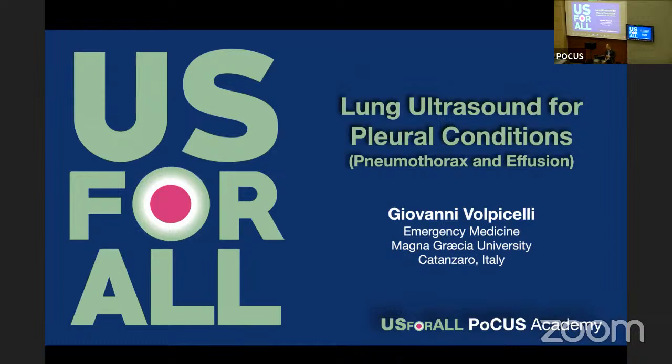This makes a difference in the patient's workup because in our practice, if the X-ray comes back negative, there is no need to refer to a CT. But if you find the ultrasound positive, then there is a reason to send for a CT. Don't forget that we are talking of a category of patients with mild situations, because if you don't see it in chest X-ray but you see it in lung ultrasound, and I agree that this happens quite often in clinical practice, usually they are not severe conditions.